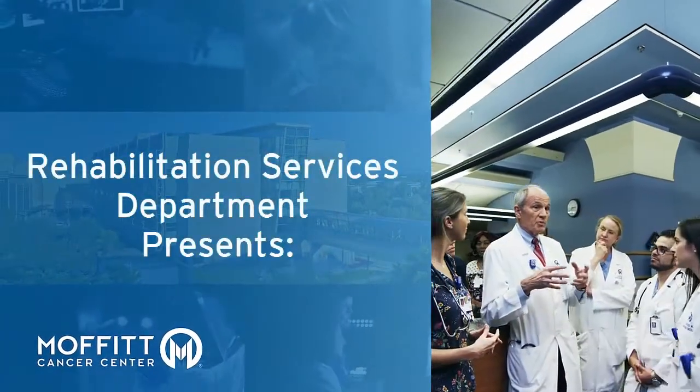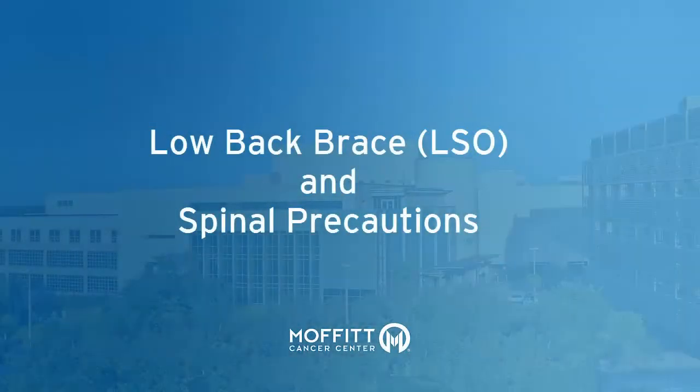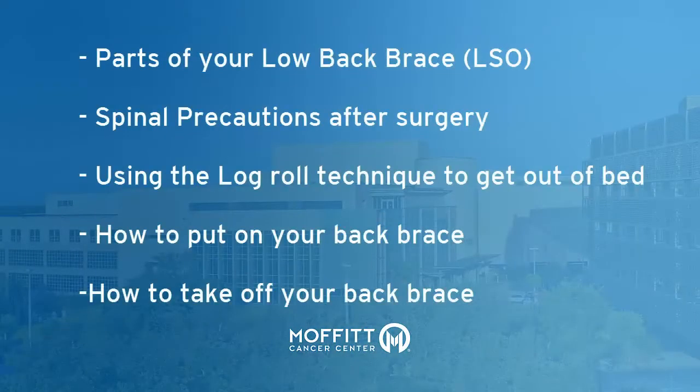This instructional video is presented by Moffitt Cancer Center's Department of Rehabilitation. This video will review parts of your brace, spinal precautions, the log roll technique, and how to put on and take off your brace.